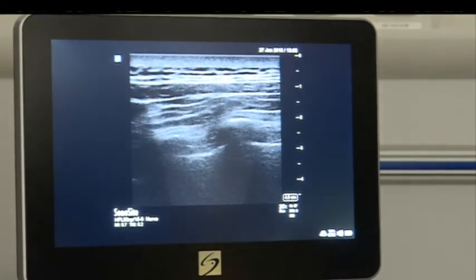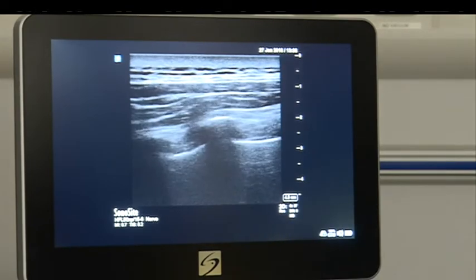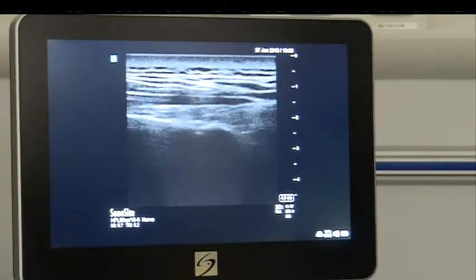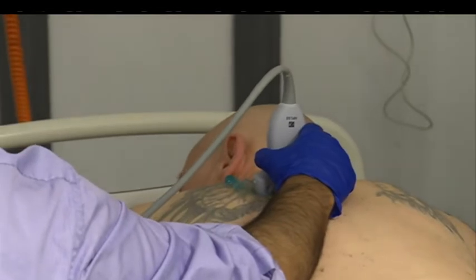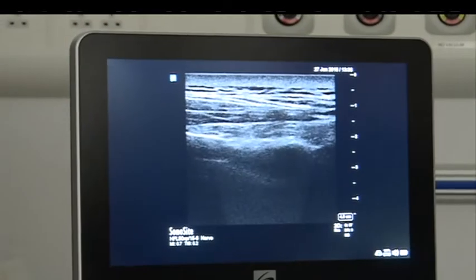What I do is keep the fourth rib in the center and then turn the probe transversely at that level. So what I am seeing now — can you tell me what you are seeing at this level right now?